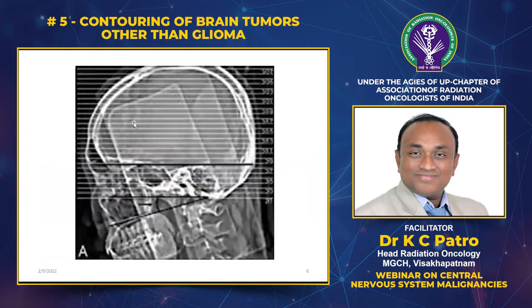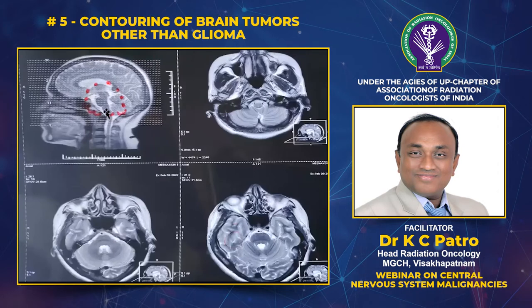We have two tools: one is the topo, and one is the scaling. If you see recent MRIs, they don't put the localizer at all. So when you are asking for imaging for patients, if you don't have 3D planning, ask your radiologist to give the topo with localizer and scale. This is how it looks: this is the topo, this is the scale here, and each corresponding localizer gives the slice. This is the method. I will clarify it, don't worry.